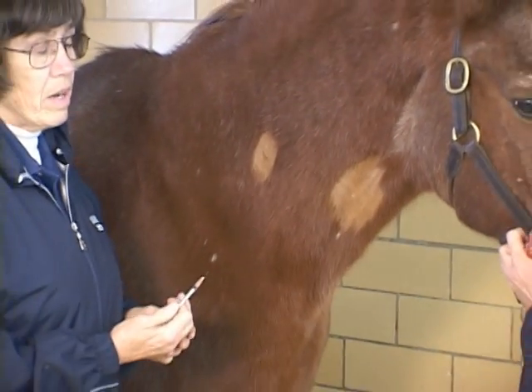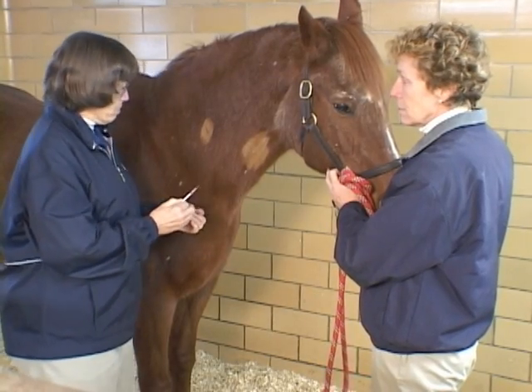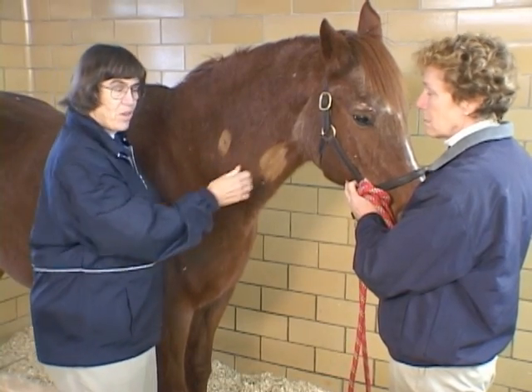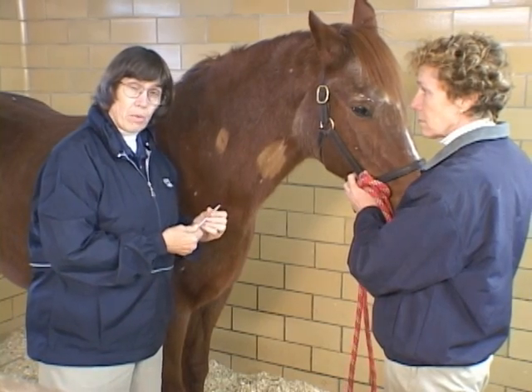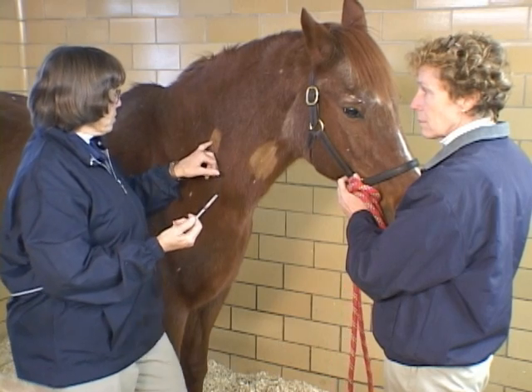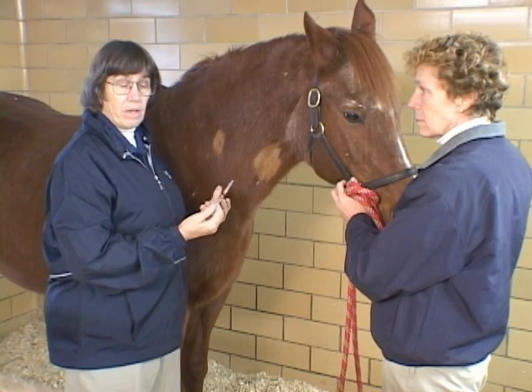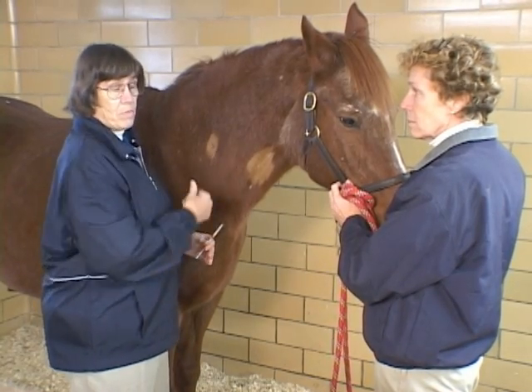Reasons that we would use intradermal injections would be if I'm testing for skin allergies — doing skin testings — and unfortunately in those situations, we end up doing a whole series of blebs along the neck here. Another thing would be for sometimes immunotherapy we're using on the animals, we might be doing some intradermal injections with that. The medications are absorbed very slowly from intradermal injections, and so that's a benefit sometimes if you want a more prolonged absorption, prolonged action for some reason.